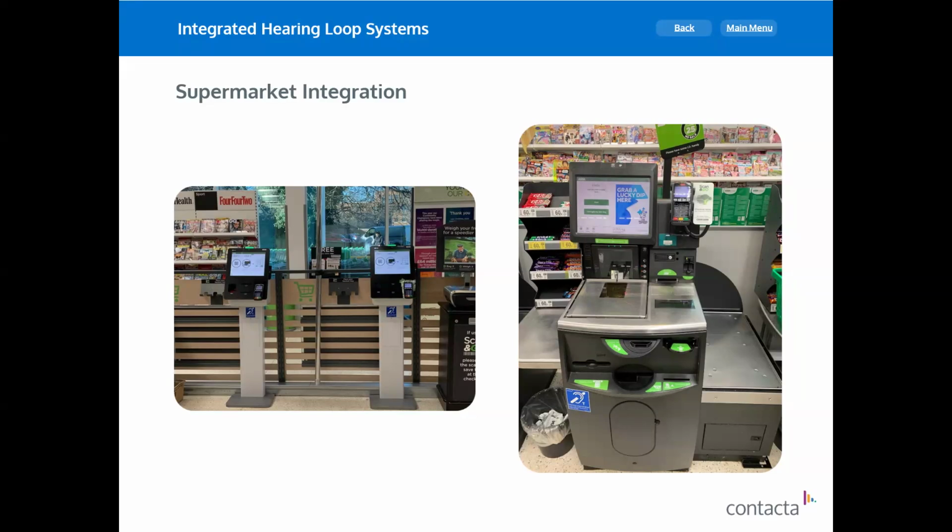The sound is important because it gives you indication of pricing, it gives you greeting messages, it gives you other messages, any problems with your card, etc. You have no chance of hearing those messages with standard hearing aids because of the environmental noise. The level of sound that's coming out of this is not very high. The speakers are very small.